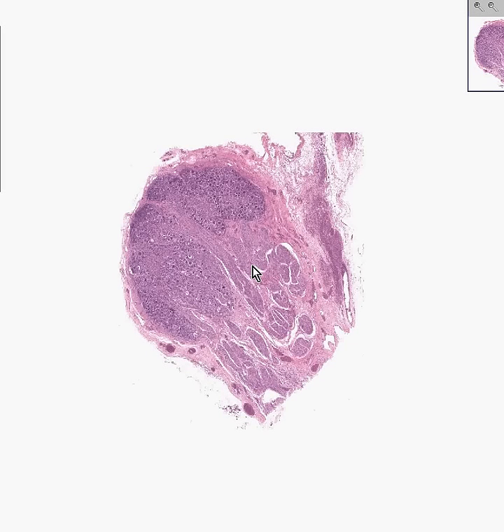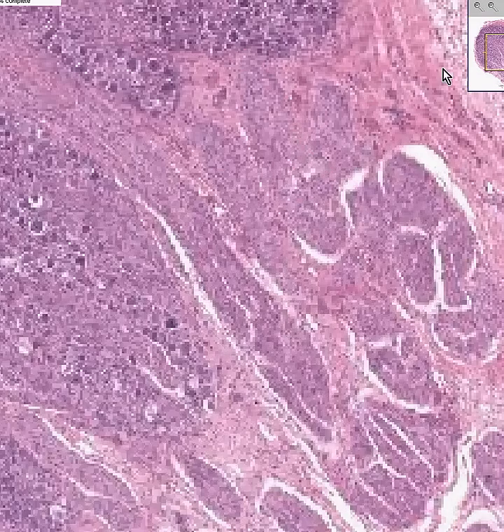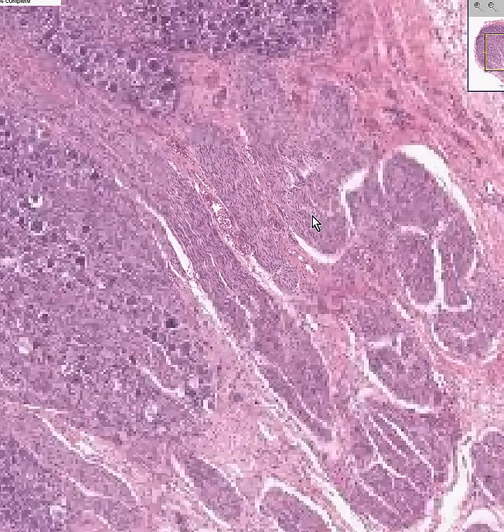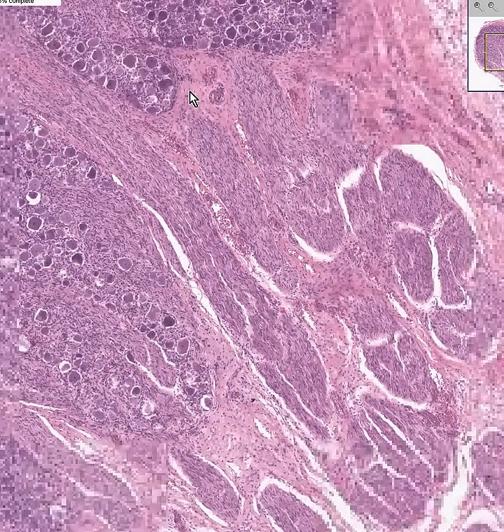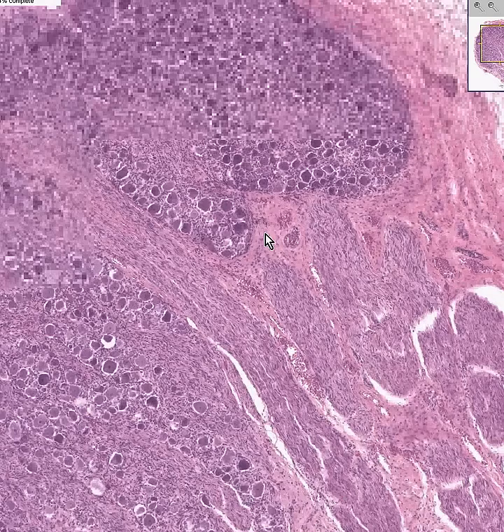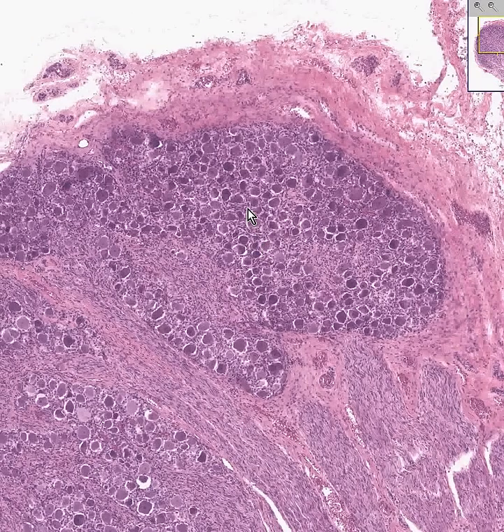What is this? Well, it'll soon become apparent. As we zoom in, we could see things that we have seen all throughout the shotgun histology series. We could see a lot of big nerves. They're wavy, they're loaded with Schwann cells, and we could see that all of these big nerves are in very close proximity to another type of tissue with huge cells. This is a ganglion — this is a dorsal root ganglion, or DRG.